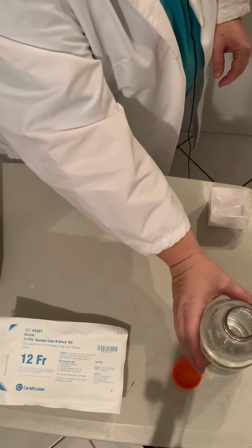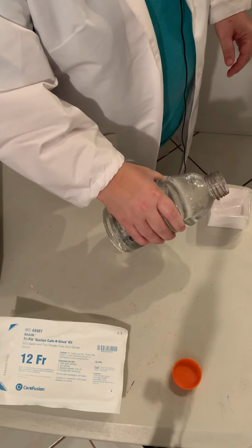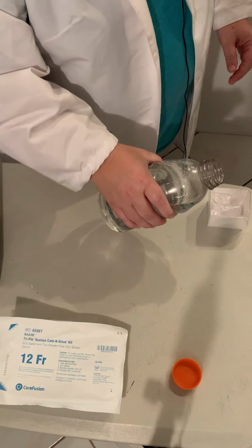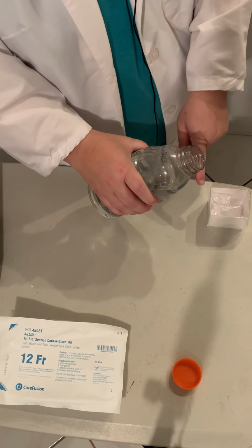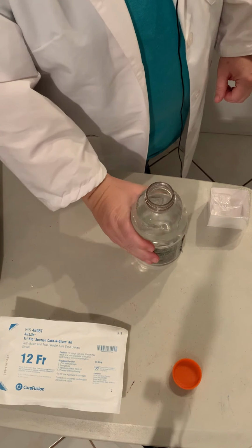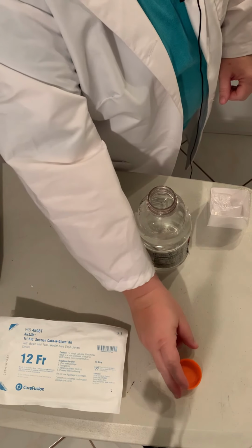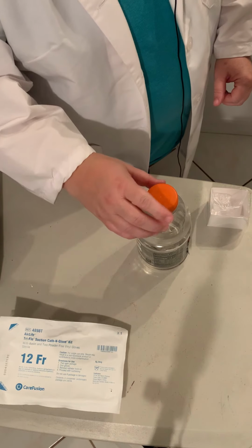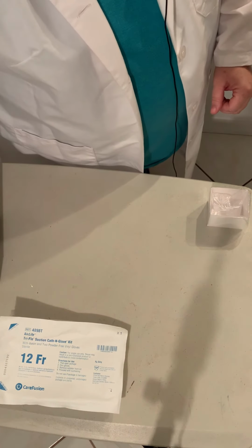So now we want to reach our sterile saline. And we're going to pour a little in. Make sure you hold it up high enough, like 2 to 4 inches, so that the rim doesn't hit the box. That will contaminate it. And you want to make sure all your items are out of your way so you're not going to be crossing your arm over your sterile field. So then we're going to put this cap back on. Okay, and we can move our saline out of the way.